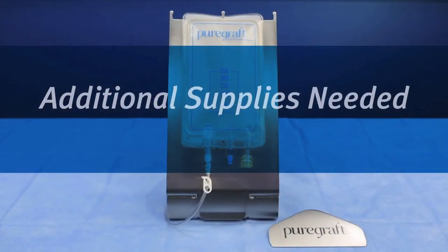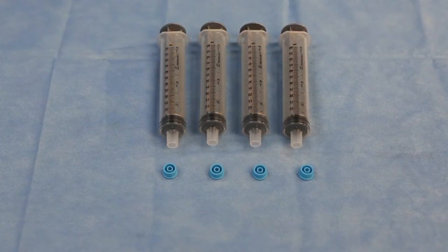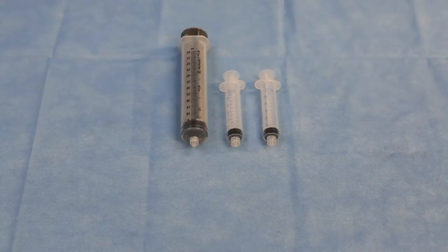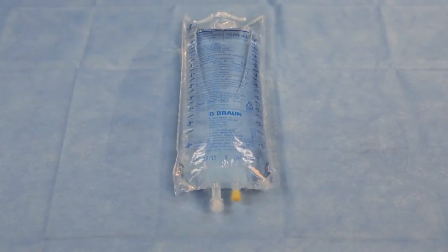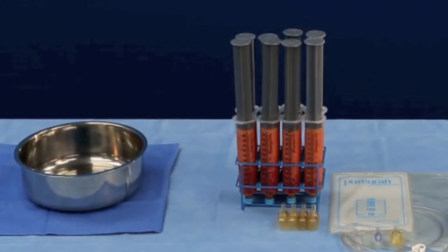A few additional supplies are needed for graft processing. These include 60 milliliter Toomey syringes and caps, luer lock syringes, and lactated Ringer's solution. A syringe stand may be used to hold the filled syringes upright. If a syringe stand is not available, this can be achieved with a bowl or jug.